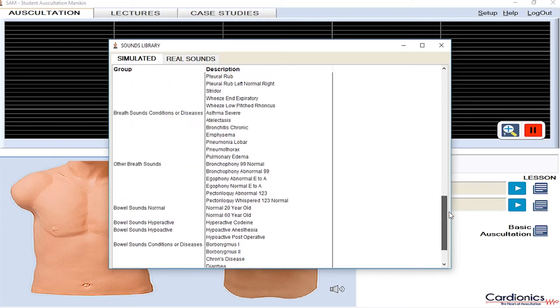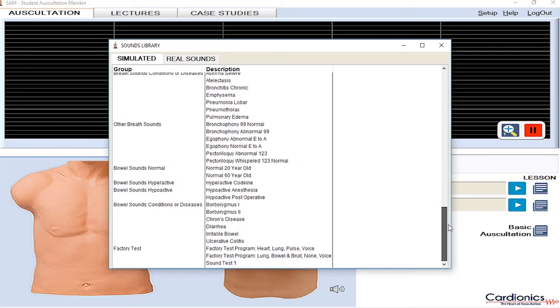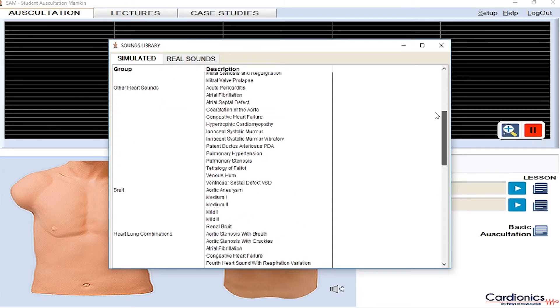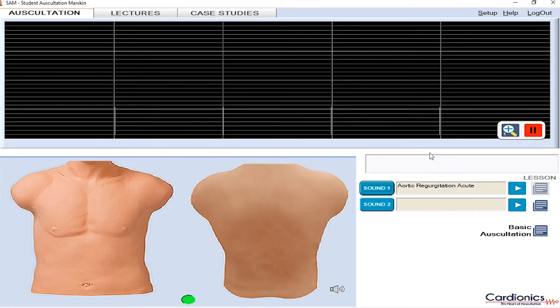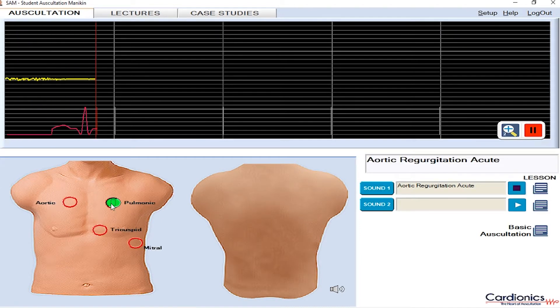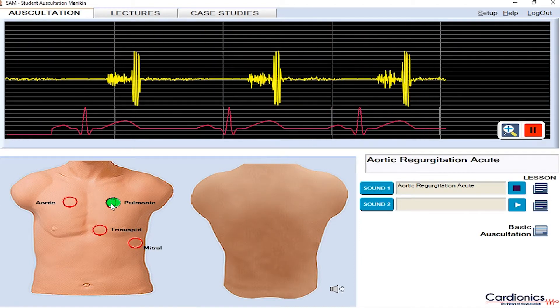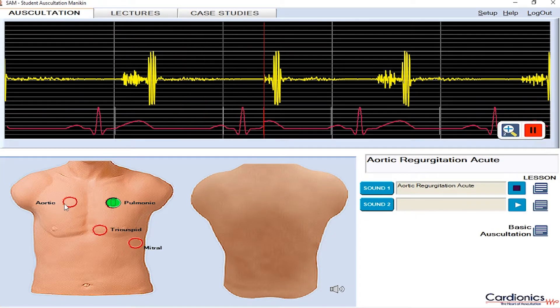To begin, select the sound you'd like to hear while auscultating. Choose from either our simulated library or Real Sounds library. To start playing the sound, click the play button and SAM is immediately ready for auscultation with any stethoscope.